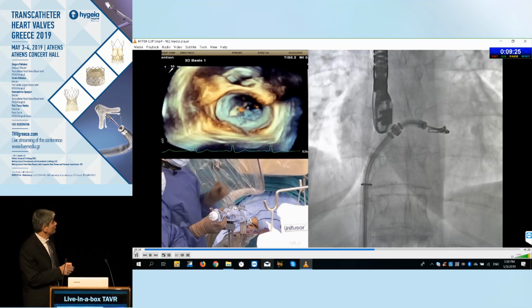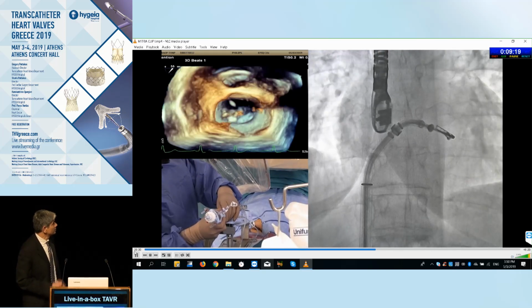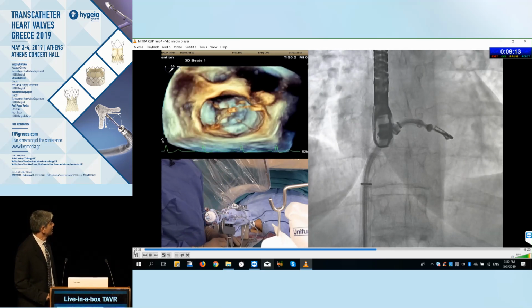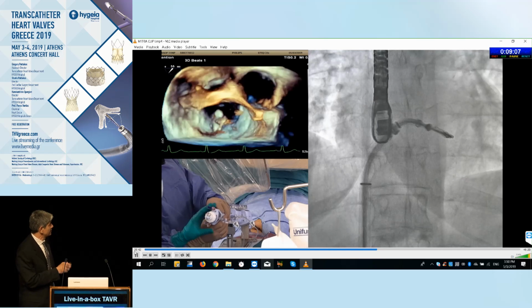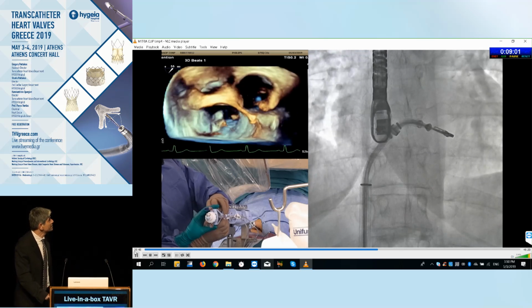Some acoustic shadowing falling off from the catheter over the anterior arm. So moving in the probe a little bit will help us be able to see both arms at the same time. And we're fairly perpendicular, maybe slightly clockwise now to come a bit more perpendicular to the valve, minor adjustments.